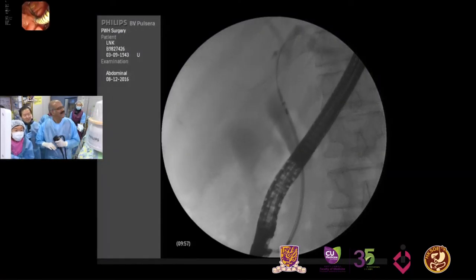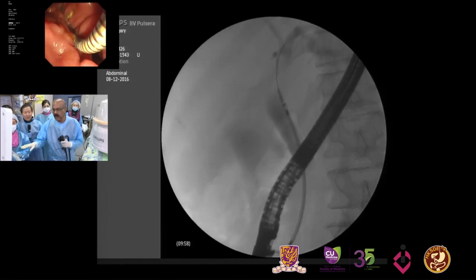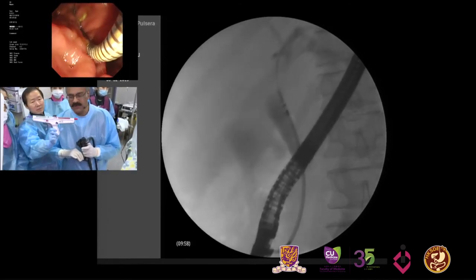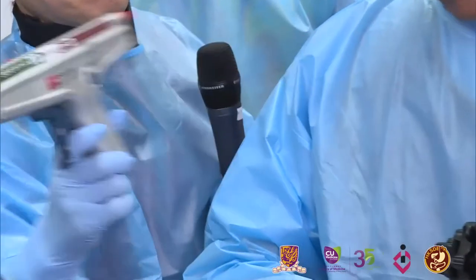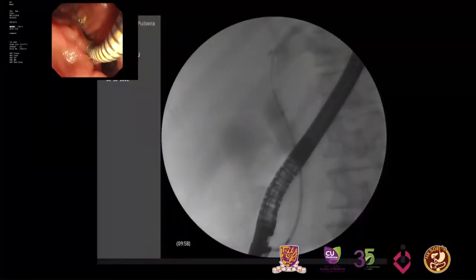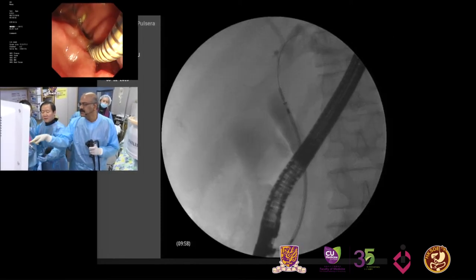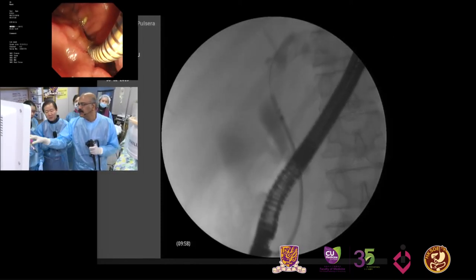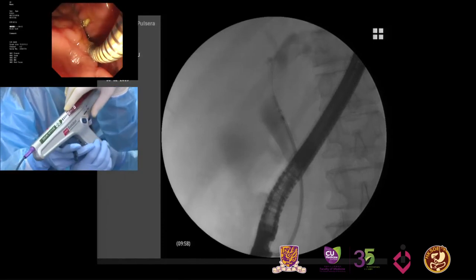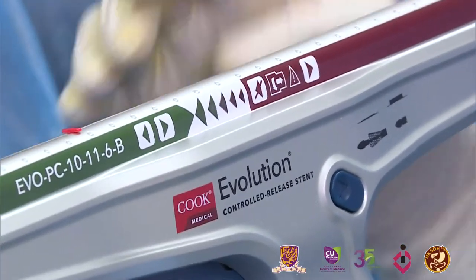Okay, so we have this Evolution stent on. I think you've seen it already. I have been given about 9 seconds to finish this now. So we have the Evolution stent on the Acrobat wire, and you can see Dongman holding the gun there. The gun has to be employed like a regular gun. Only thing is, as the trigger goes on, the red knob that you get here comes to a stage where the camera can see it. If it goes to this stage, it's a no-return stage. So we quickly do that.